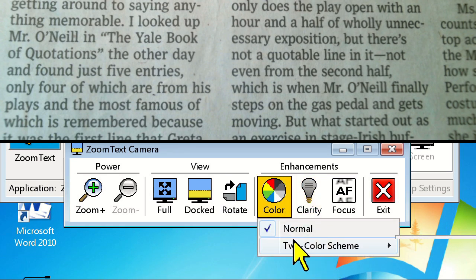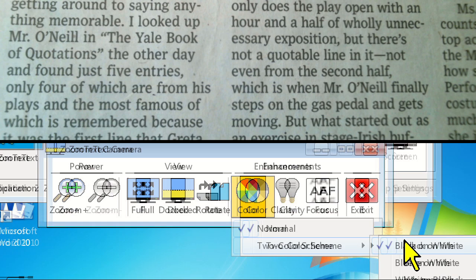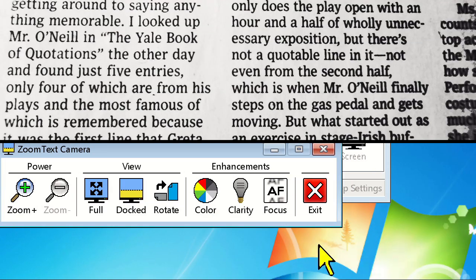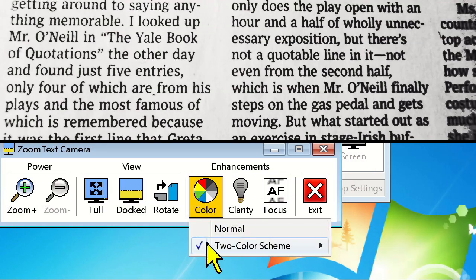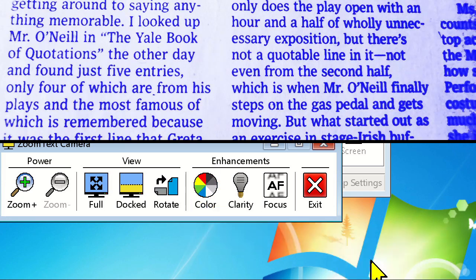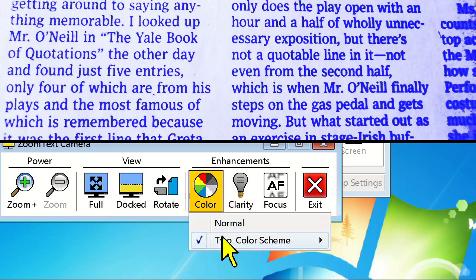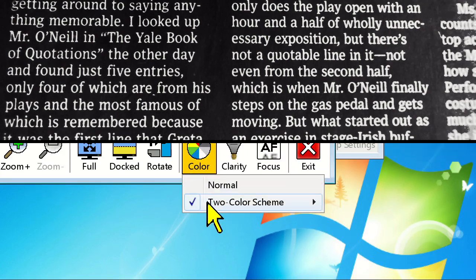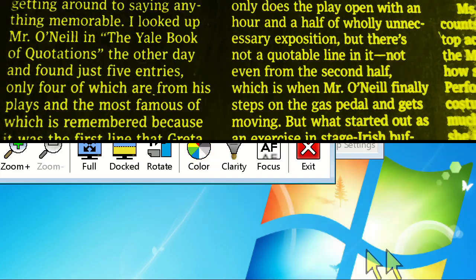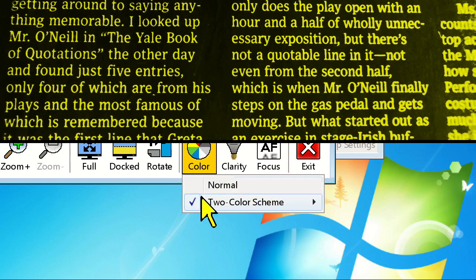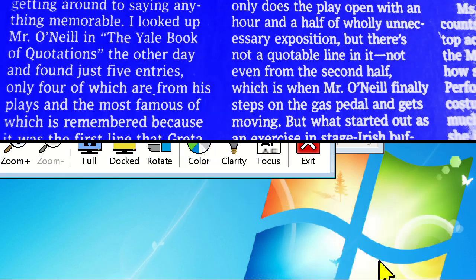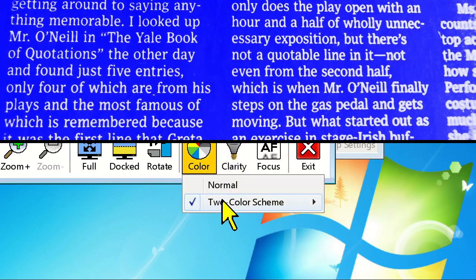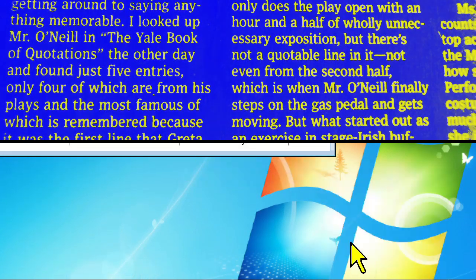Notice the color icon, which, similar to the ZoomText color enhancement, offers several high contrast color filtering modes, including black on white, blue on white, white on black, yellow on black, white on blue, and yellow on blue.